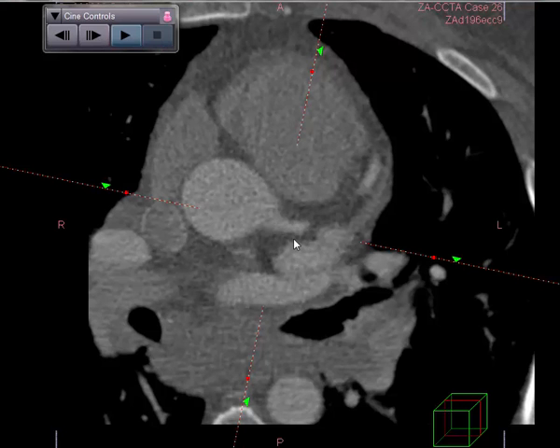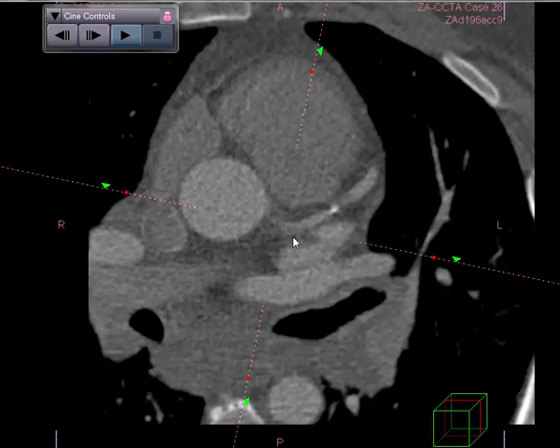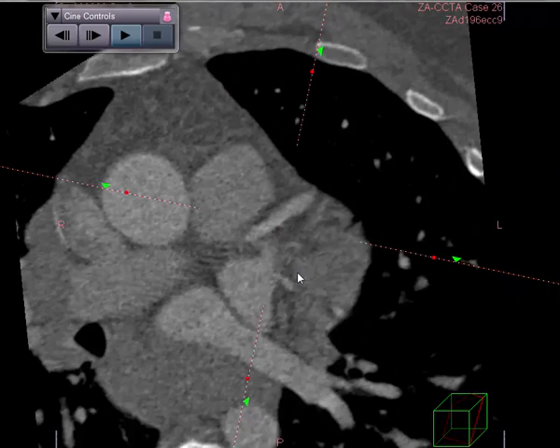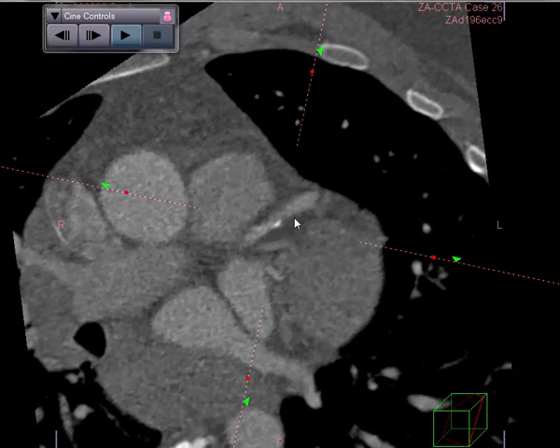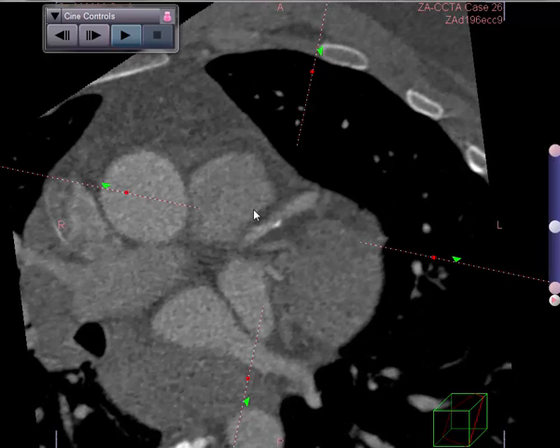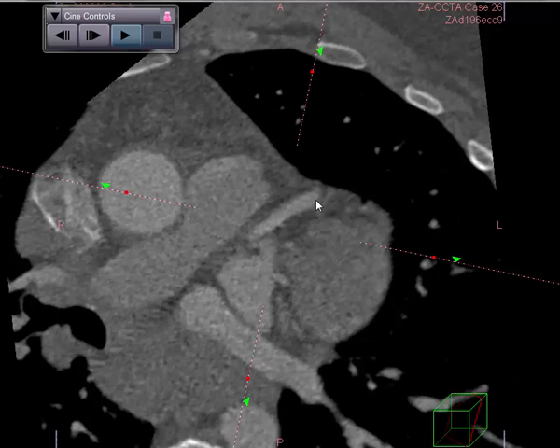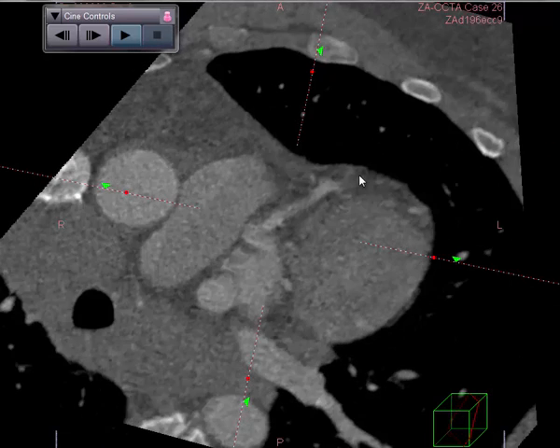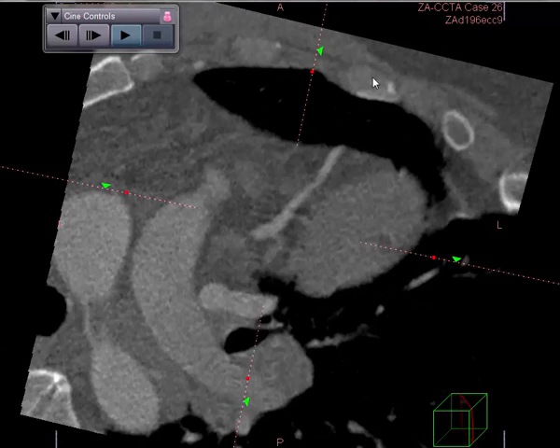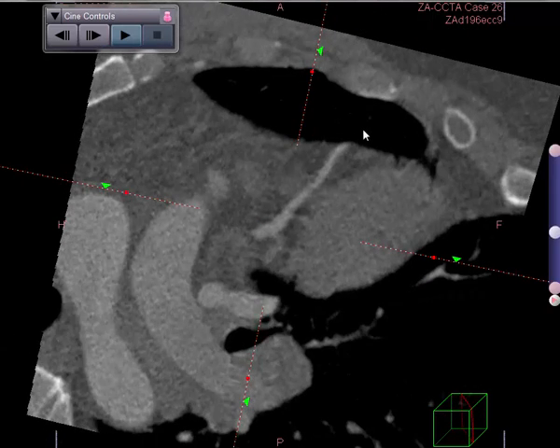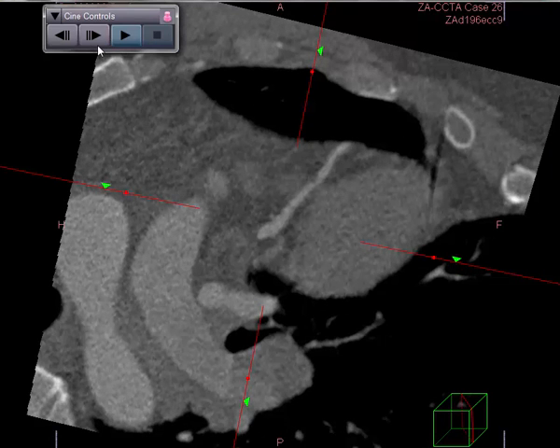The left main appears to be normal. Proceeding down into the left anterior descending, we can rotate around this. This appears to be possibly mixed but eccentric non-obstructive disease involving the LAD. The remainder of the vessel is actually normal. You have to play with it a little bit, changing phases along the way, but this appears to be normal.